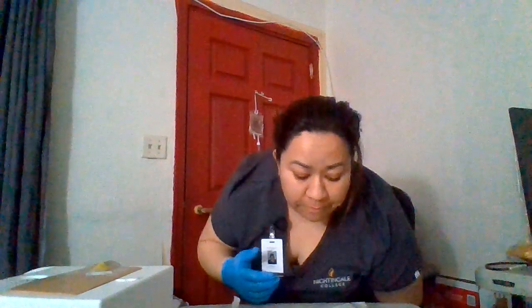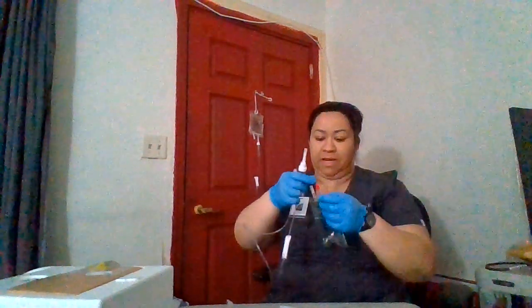And now I'm going to be preparing my piggyback, so my antibiotics, the amoxicillin. This is my secondary tubing, and it's pretty much exactly the same as the primary tubing. You have your spike, your drip chamber, your roller clamp here. So we're gonna roll it closed. Okay, and the adapter. But this adapter will not be connected to the IV site, it will be connected to the Y connector. So first thing is we're gonna be spiking our bag.